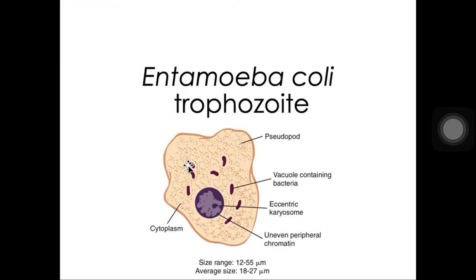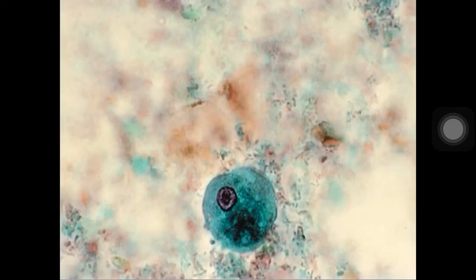Tapos kung kanina ang pseudopod natin ay isa lang, finger-like pseudopod for histolytica, for coli, it will release many pseudopods, pero dahil nga sabay-sabay sila, yung mga pseudopod, the direction will be non-directional, non-progressive, saka sluggish yung kanyang movement. So the movement here is non-progressive, non-directional, sluggish movement for your Entamoeba coli. So again, going back here, this one is Entamoeba coli trophozoite.